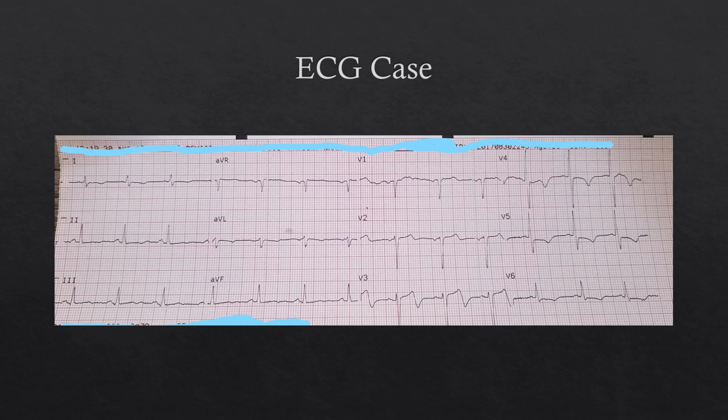What is Wellens? Why would we see this? So the reason that they need to have a dramatic reduction in symptoms or be pain-free is that Wellens is an example of reperfusion to the myocardium. So what happened underneath is this patient had 100% LAD occlusion or a near complete occlusion, and then something happened and a little bit of blood flow was restored to the myocardium.